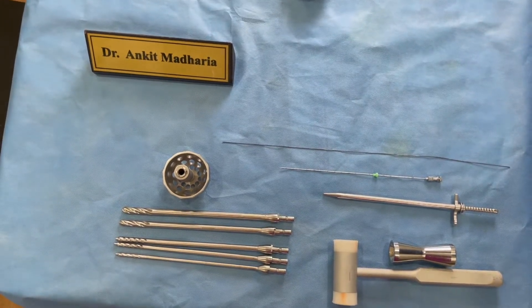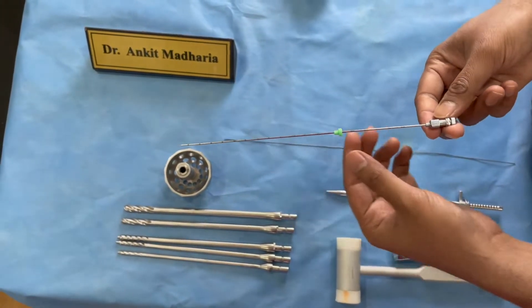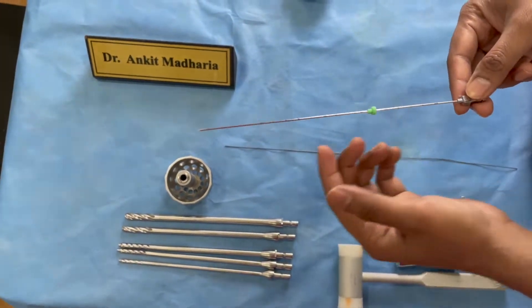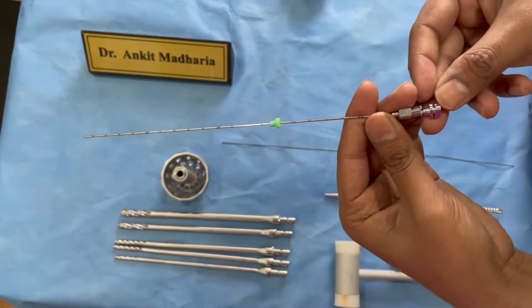These are the basic access instruments. The first thing you need to have is a needle. This is an 18 gauge autoclavable needle that we can reuse multiple times. This is a 20 cm long needle which has a slit over here which demarcates the bevel.